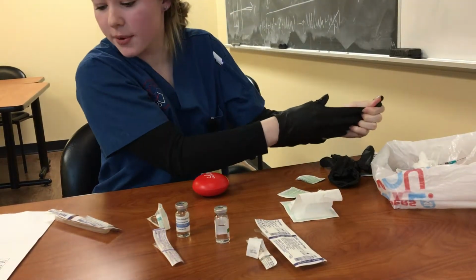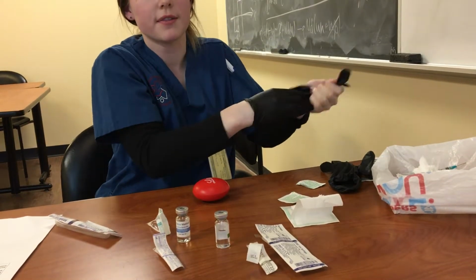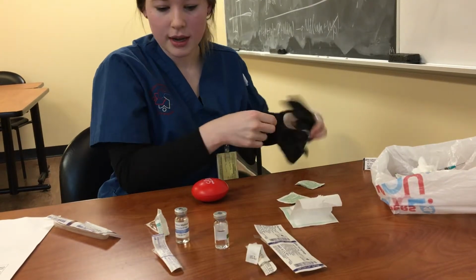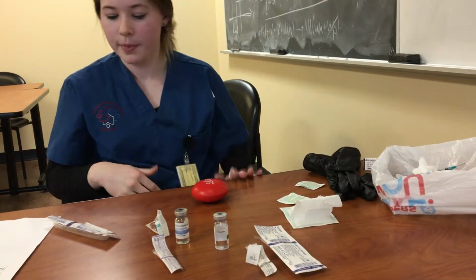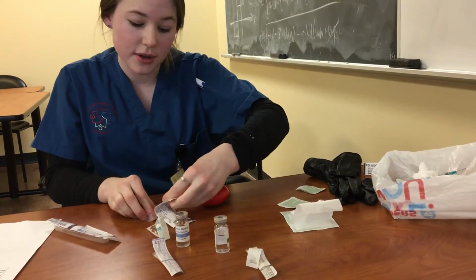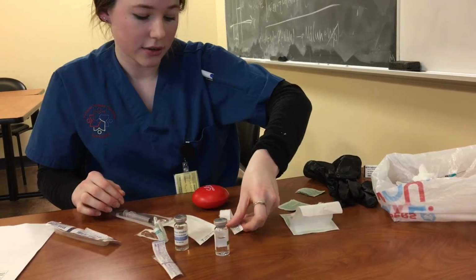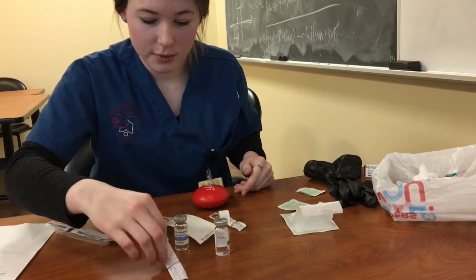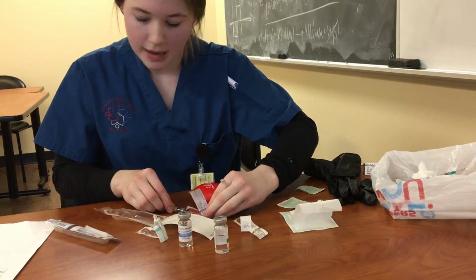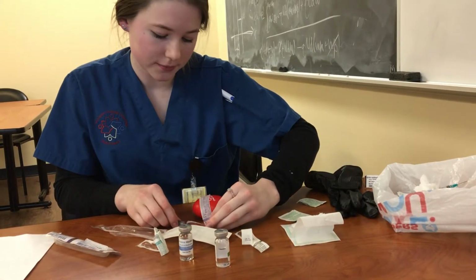So the next medication that we're going to be giving today is Haldol, and we're going to be giving 1 milligram, but this time we're going to be giving an intramuscular injection, so a little bit different. Now that I'm back in the medication room, I'm going to get my IM syringe, which we've already talked about. It's a 1 to 3 milliliter syringe, and I'm just going to grab the blunt needle to aspirate the medication. And today we are giving 0.5 mils of Haldol.